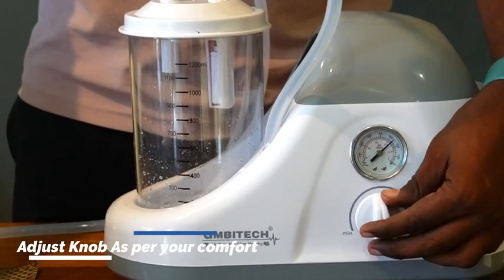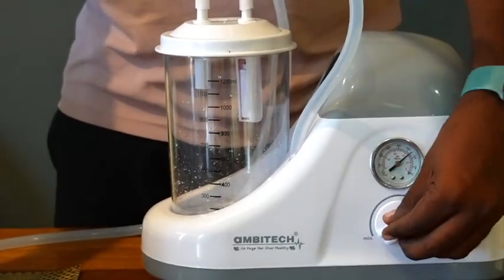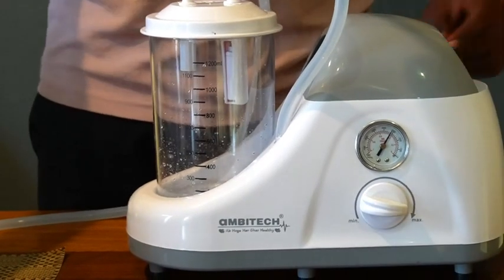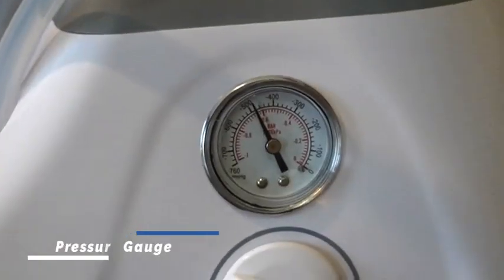With our new technology, you can rest assured that the phlegm or mucus does not enter the machine but is collected and contained in the suction jar. You can monitor the suction pressure at all times with the help of the pressure gauge.